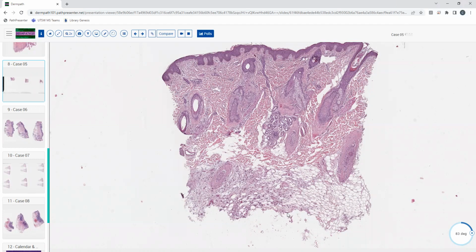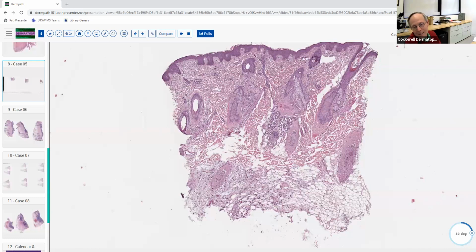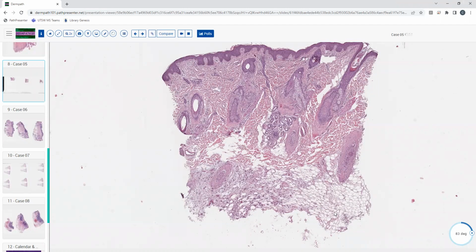Hmm. Oh, yeah, I guess we hope not. We really hope not. The follicles should be really deeper, you know? Yeah, you would have about 8 to 10 normal, beautiful, luxuriant hair follicles sitting right down here in the subcutaneous fat with nice hair bulbs, and it would look so healthy that it wouldn't look anything like this. What do you think this person's scalp looked like clinically? I suspect they're having some problems with hair loss, which is why they got a scalp biopsy. You would think so. Yes, they've got one follicle in this deep part of the fat.